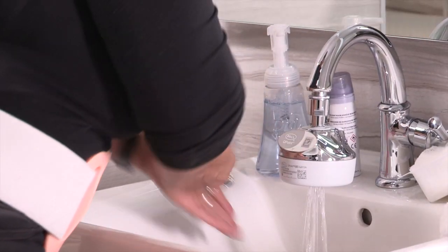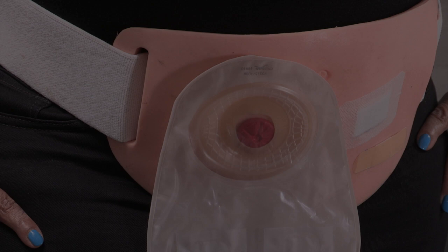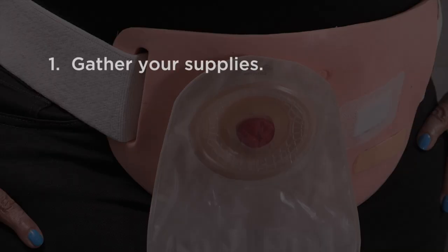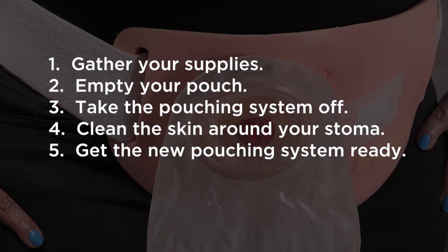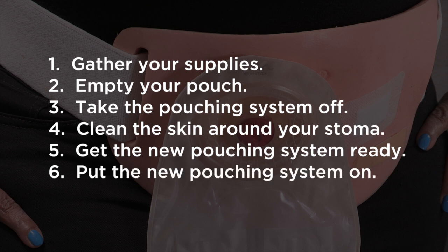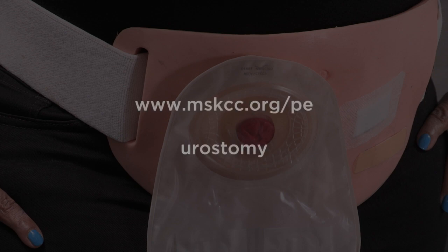Then wash your hands with soap and water or use an alcohol-based hand sanitizer. You're now finished changing your urostomy pouching system. As a reminder, the steps are: gather your supplies, empty your pouch, take the pouching system off, clean the skin around your stoma, get the new pouching system ready, and put the new pouching system on. If you have any questions, you can find more resources at www.mskcc.org/PE and search for urostomy, or ask your nurse for more information.